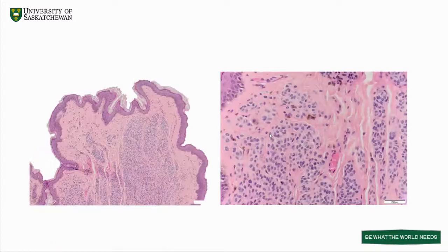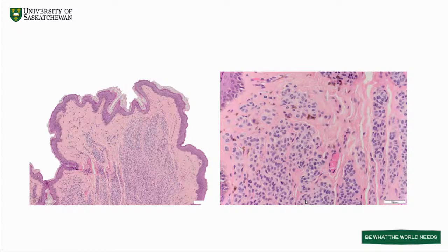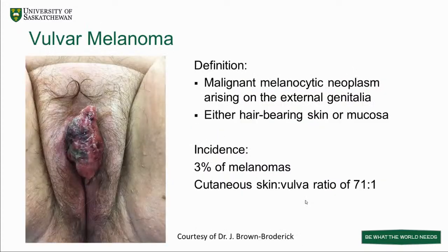So we have this exophytic lesion here that you can think they might have thought was a skin tag because it kind of has that wrinkled look. But when you look, you can clearly see that there's something in the stroma here, and even just this look of the pigment. So it's a primarily intradermal component, and these are very small. They do have all of the features that you would normally have for a nevus at a site other than a genital site. But you can imagine that this looks like it's going quite deep down, so you would be concerned about that. But then again, you would remember that this is a special site and that there are no other high risk features here. So then we're going to dive right into vulvar melanoma.